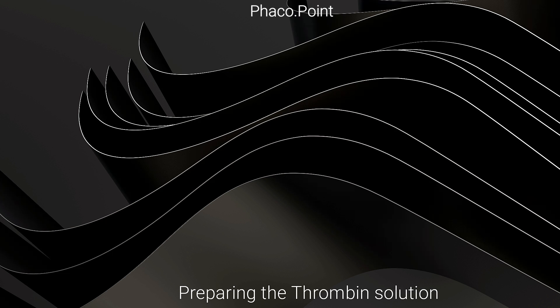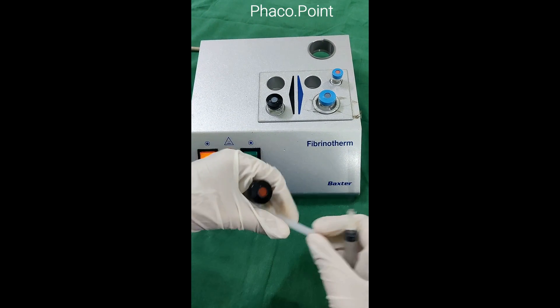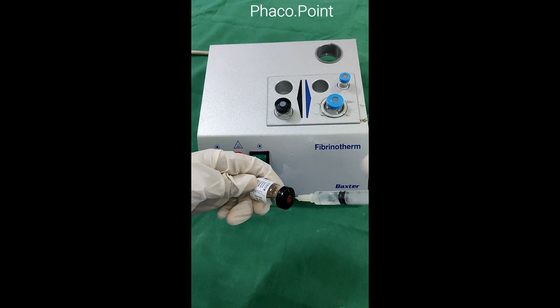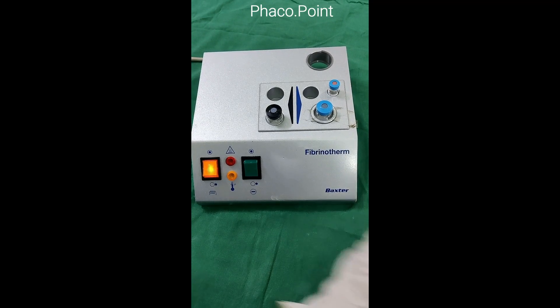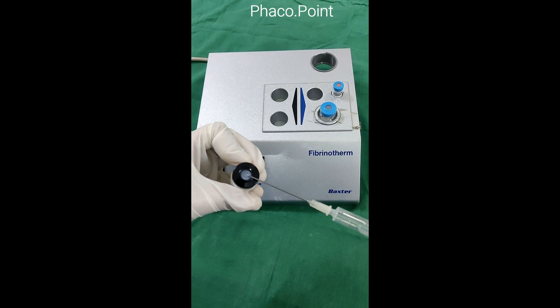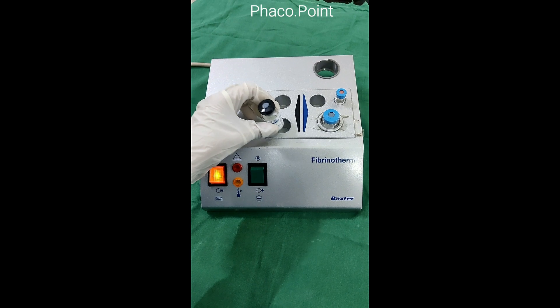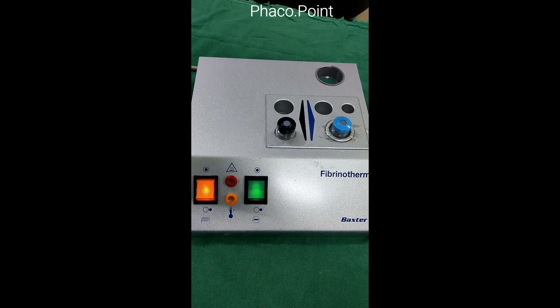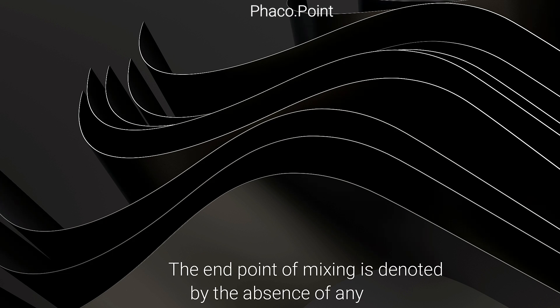Next we create the thrombin solution. We take the syringe with black writing connected to a brand new 18-gauge needle to carefully draw out the calcium chloride liquid, then inject it into the black bottle containing the thrombin powder. Again, care must be taken to avoid air bubbles. With both bottles now in the Fibrinotherm, the green switch is activated, and approximately 10 minutes of gentle mixing dissolves the powders into solution.